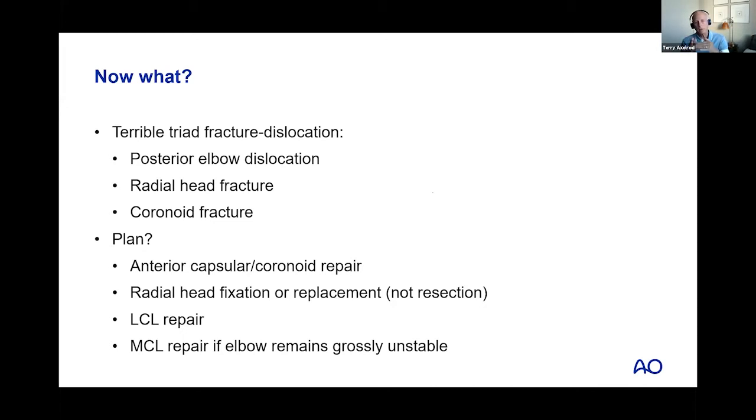And so often you see people that have done a really tremendous job of fixing the radial head itself, they don't get the angle quite right. And so, like you said, it ends up looking much like your pre-op x-ray looked, where you have this angular deformity at the neck shaft angle. And I think that creates additional problems and doesn't really contribute to the stability of the elbow that you really need.